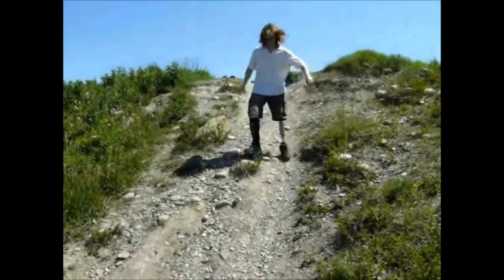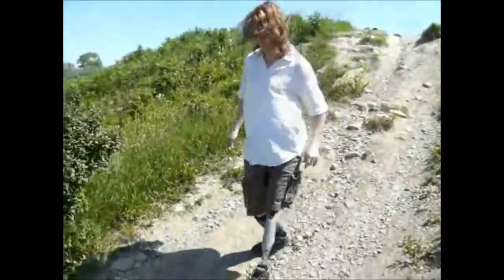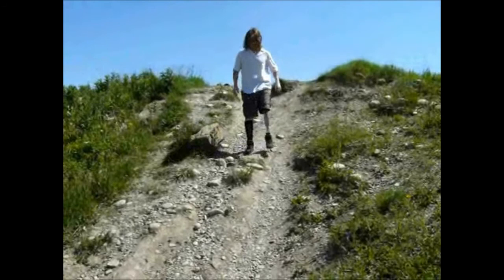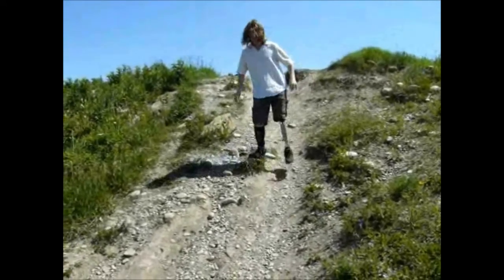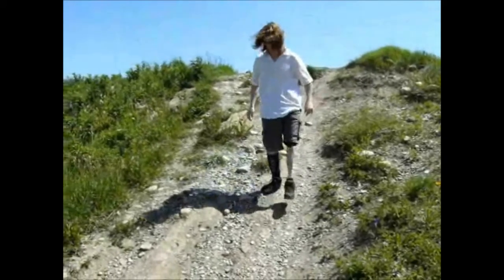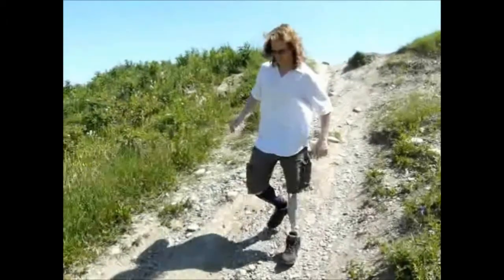This is probably the scariest type of obstacle that amputees face, and that's going down a steep slope with a gravel kind of surface, no traction, and to be able to trust an above knee prosthesis on awkward, slippery slope is very difficult.